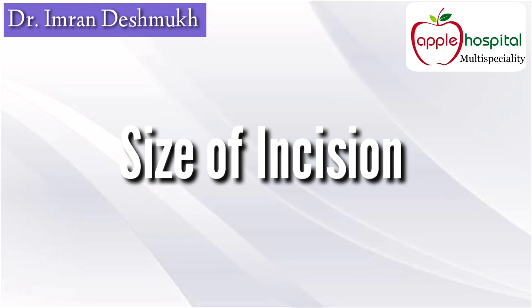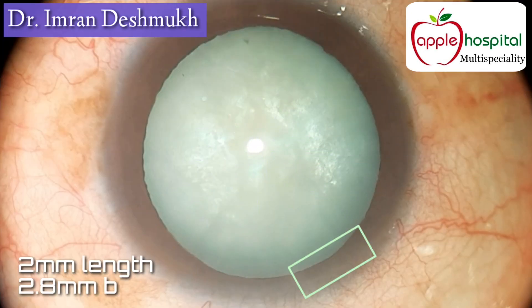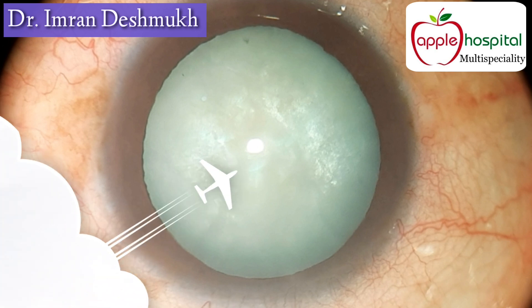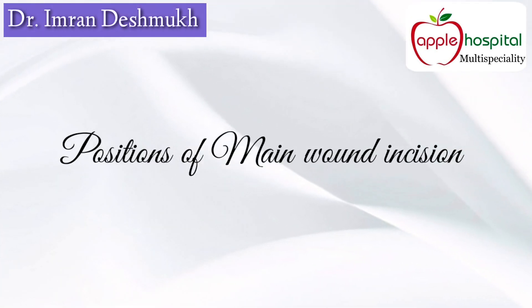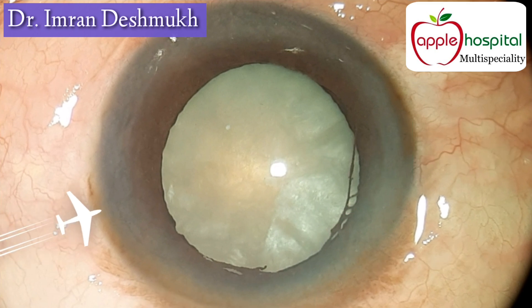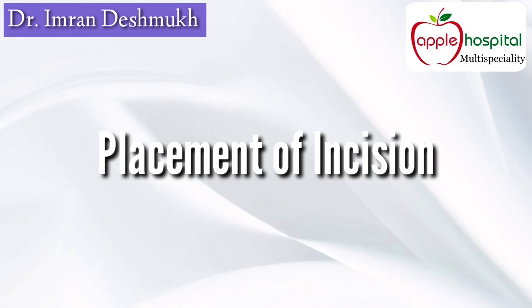Here are a few important points. Firstly, the size of the incision: ideally it should be 2.2 millimeters in length and 2.8 millimeters in breadth — not more, not less. Secondly, the position of the incision: there are three positions — superior, super-temporal, and temporal — and it is up to the surgeon's choice.